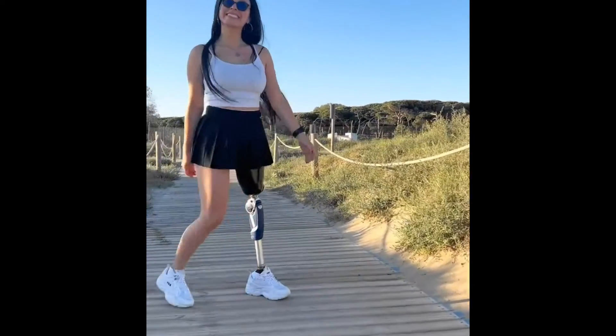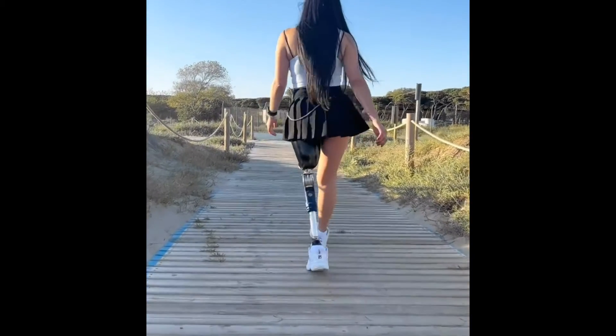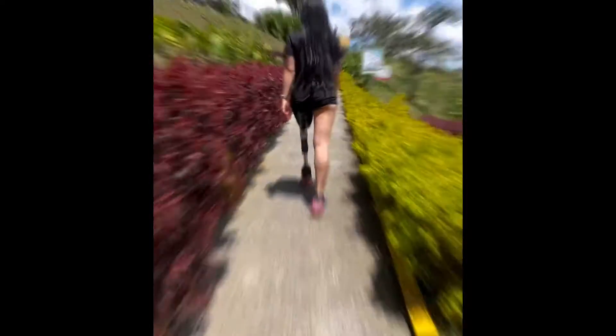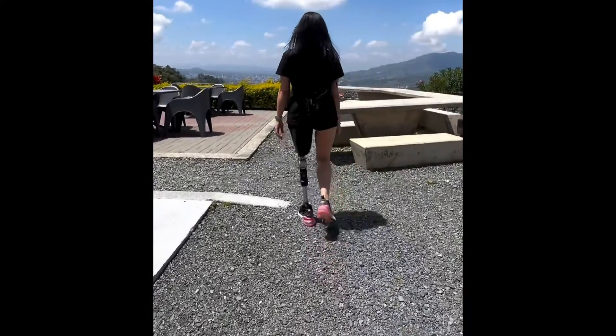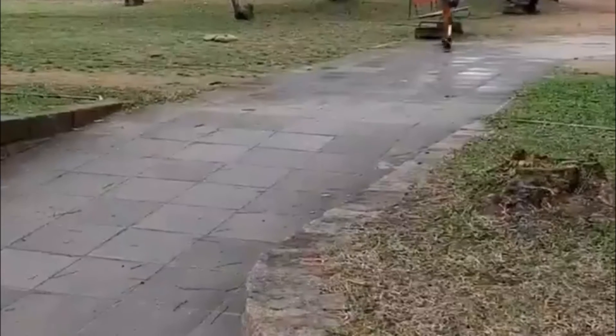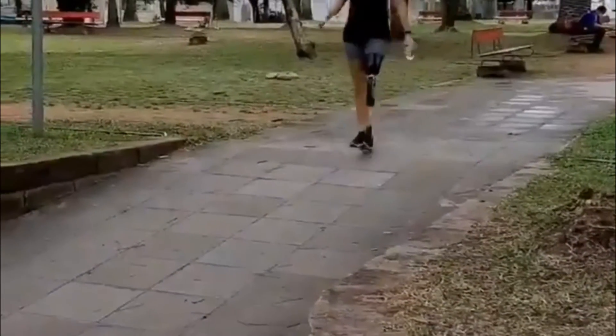Bench alignment, static alignment, dynamic trial fitting. These steps are first carried out with a test prosthesis in order to determine the best possible combination and positioning of the prosthetic components relative to each other. Once all settings have been tailored to the patient, the definitive prosthesis is produced. The same steps are repeated for this purpose.